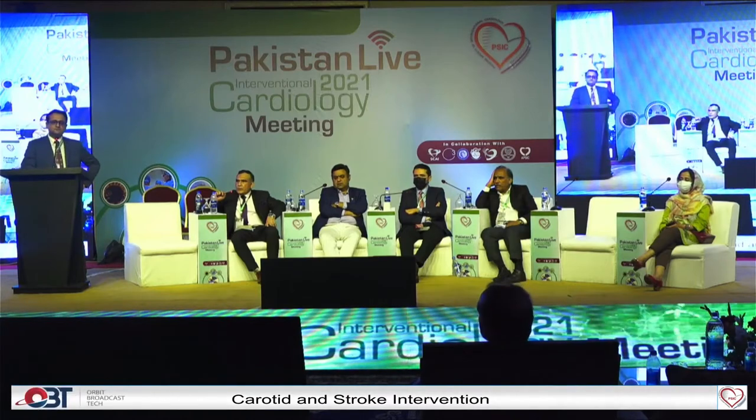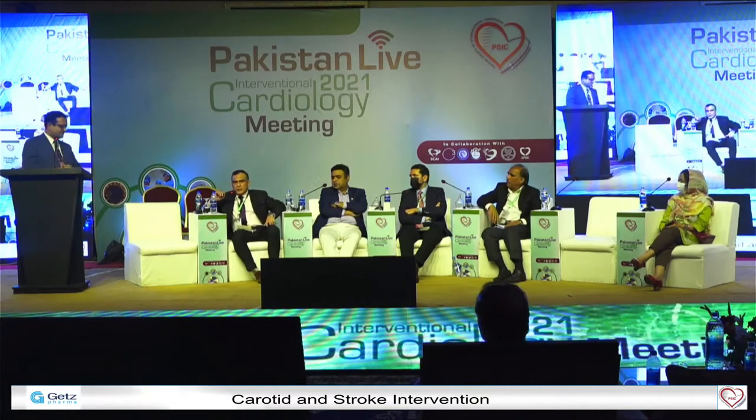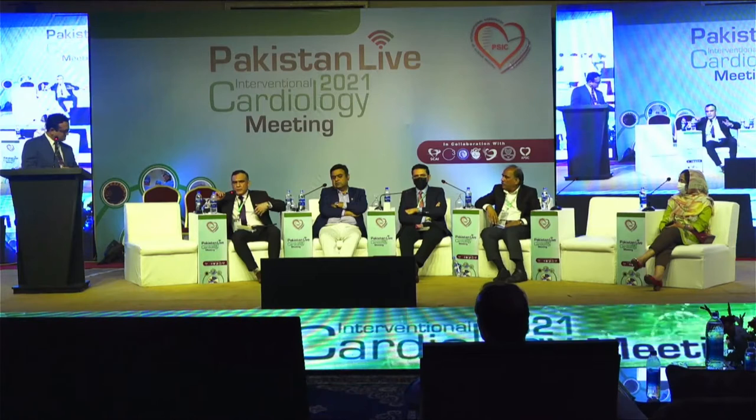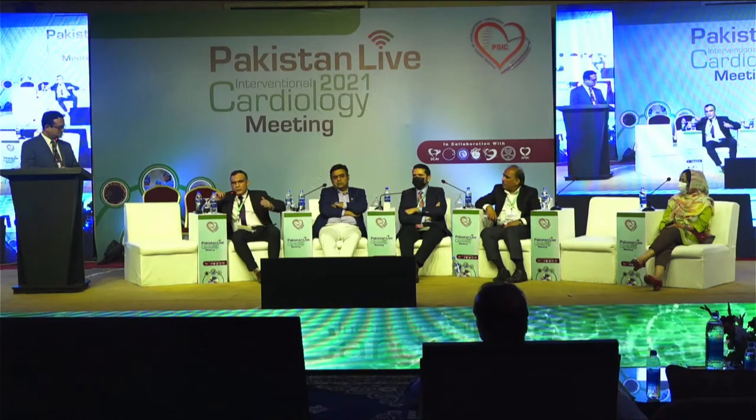Can I just make a comment if you're waiting? Sure, go ahead. This is about the imaging in left main. Initially, when we started left main at NICVD, I used to image all of that. Every single case in the left main was imaged. Then we found out that our post-stent optimization, as you mentioned, hardly made any difference to our procedure because we already got used to them.